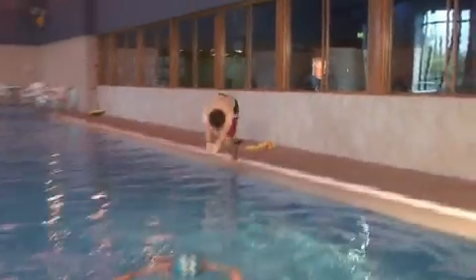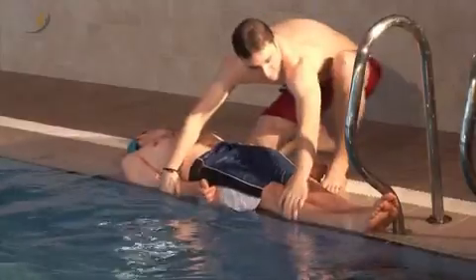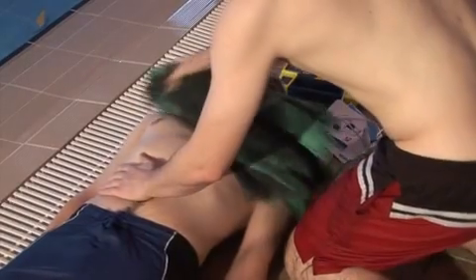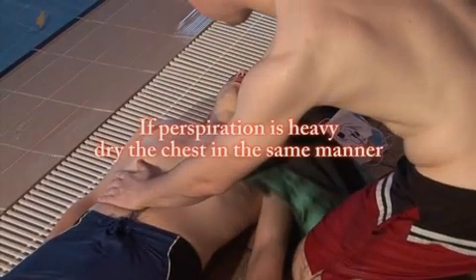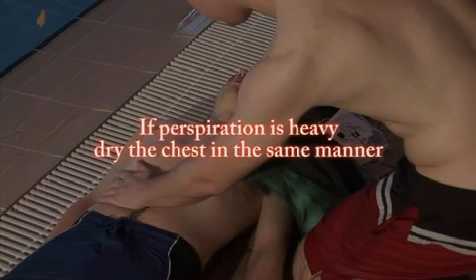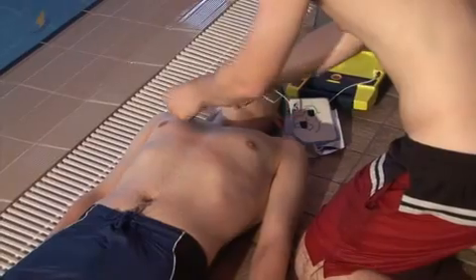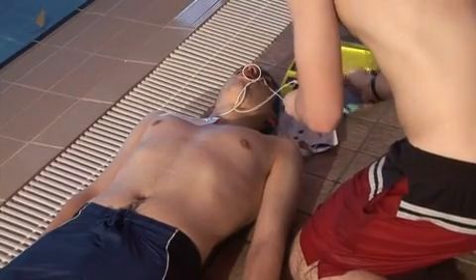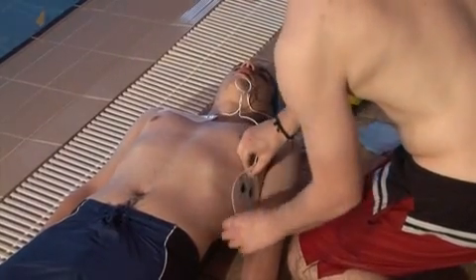Whenever water is near a patient in cardiac arrest, quickly move the patient away from standing water, dry the chest, and apply the electrode pads. As long as the chest is dry and the pads are securely attached to the chest, the risk of shock to the responder is very low.